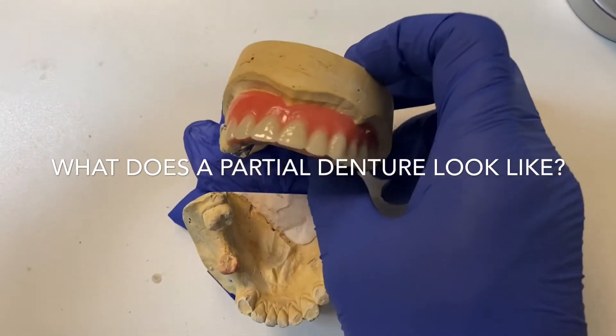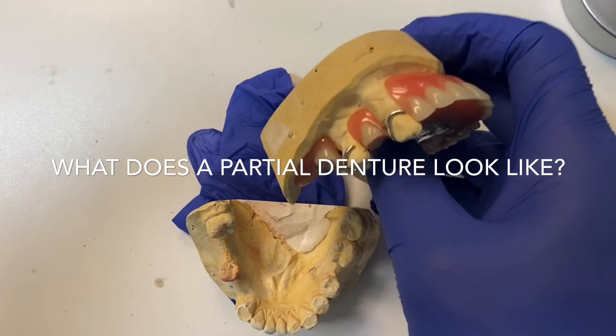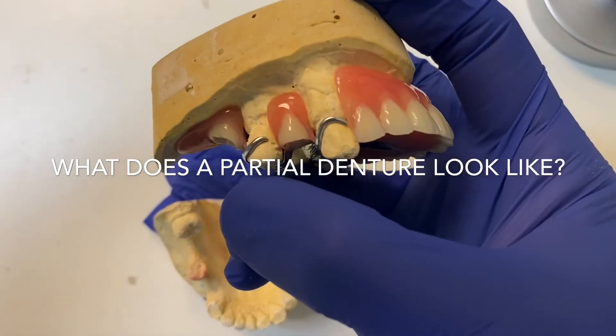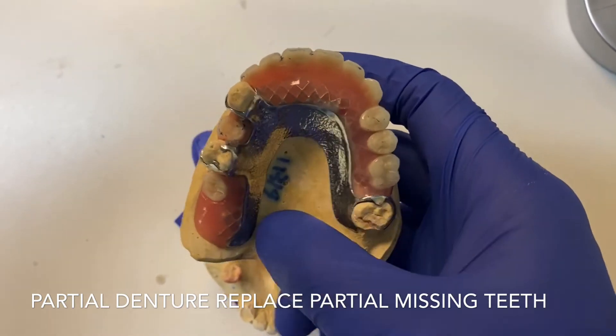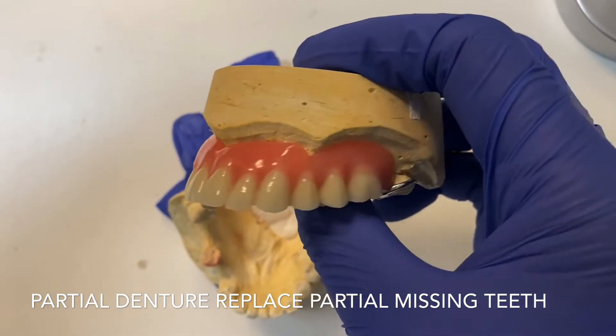This is called a partial denture, as you can see. There are only three teeth remaining in the patient's mouth — this is one, number two, and that is number three. So there are only three teeth left, and this is the illustration of a simple partial denture.